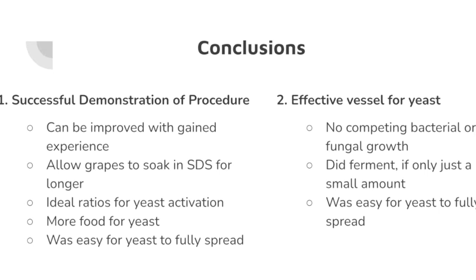It did, however, turn out to be an effective vessel for yeast, though. There was no competing bacterial or fungi growth. It did ferment, if only just a small amount, and it was easy for the yeast to fully spread.